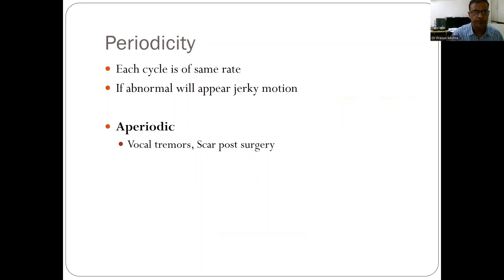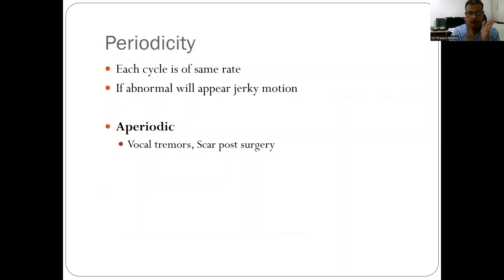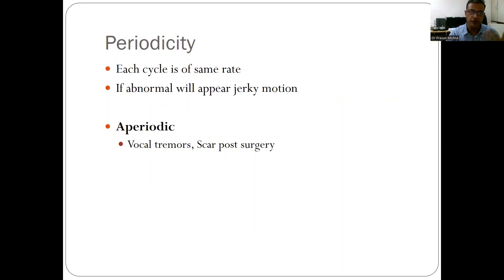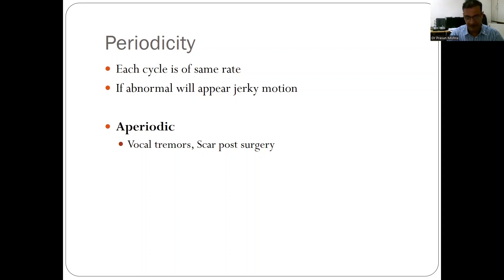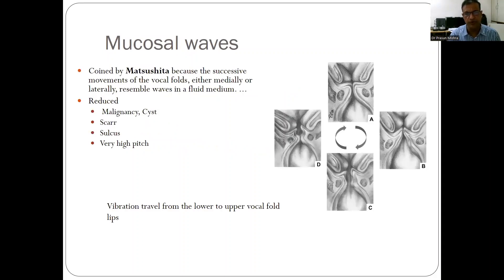Periodicity is difficult to determine on a normal stroboscopy because each vibratory cycle of right and left sides should be at the same pace. If the cycle is irregular, we may see jerky movements of the vocal cord. Periodicity abnormalities are seen in vocal cord tremors or scarring following surgery. To comment precisely on periodicity, a high-speed camera is required, which gives a better assessment than stroboscopy alone.